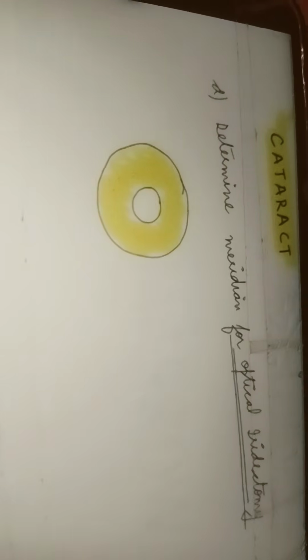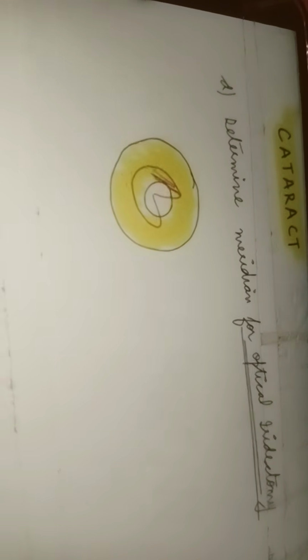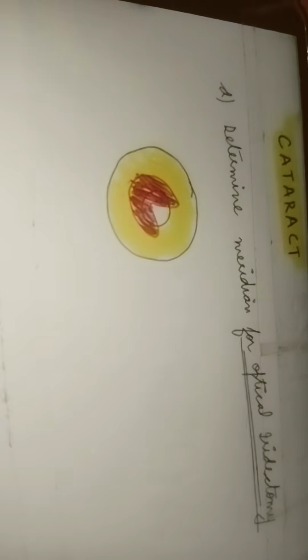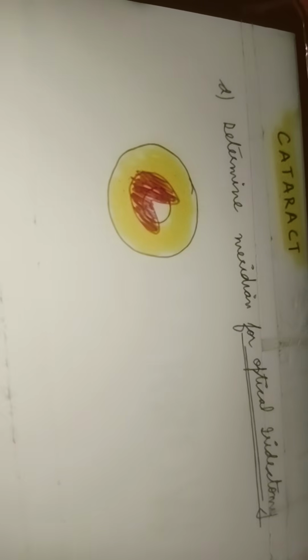Now there is a corneal opacity. This is the corneal opacity, let's say. Now, as you would be able to see, this corneal opacity is blocking the majority of the pupillary area, due to which the vision of the patient is compromised. So we are saying, can we cut the iris in some certain position such that the vision of the patient will improve? I'm saying yes. So I keep a stenopaeic slit in front of the patient's eye. I rotate it in whichever axis.